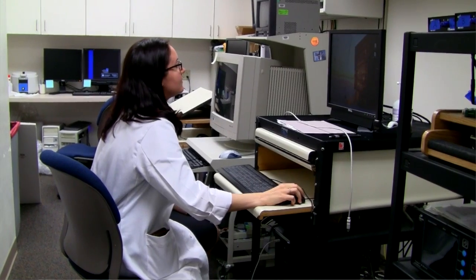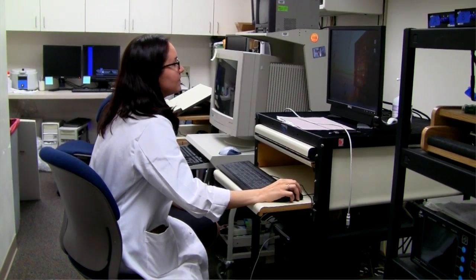And let's see, after the laboratory session is over, data analysis begins, and each recording file is corrected for artifacts using semi-automated processes, visual inspection as well, removing those eye blinks and those muscle movements. Sometimes data are noisy and you need additional filters to clear them up. But sometimes data aren't always salvageable if the recording was not done well and impedance was too high.